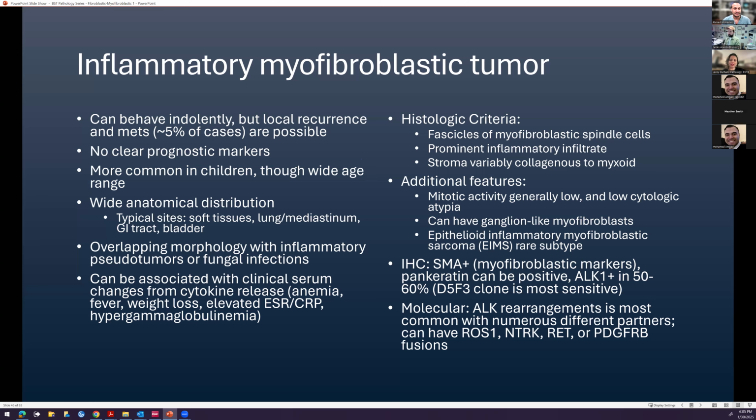What other ALK tumors do you know, by the way? There's actually quite a number that will stain with ALK. Weirdly enough, even though we think, oh, it's got to be IMT, it's ALK, right? There's ALK-associated histiocytosis. Exactly. I think Heather, you've looked at too many histiocytic things. Yeah, ALK histiocytosis, or sometimes called epithelioid fibrous histiocytomas of the skin. They'll have ALK, right? So it's sort of an ALK histiocytosis.